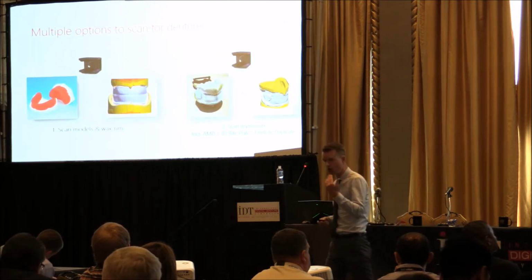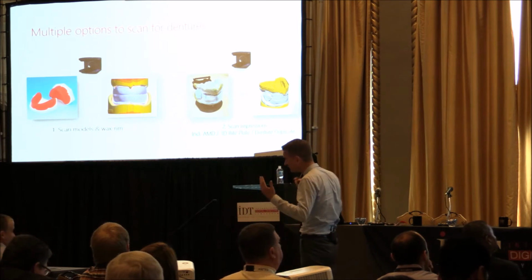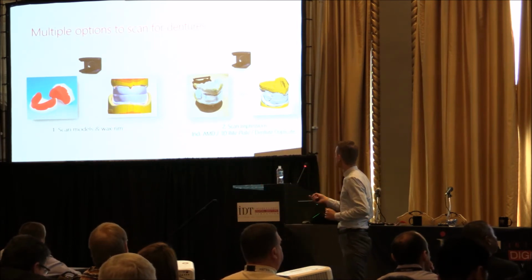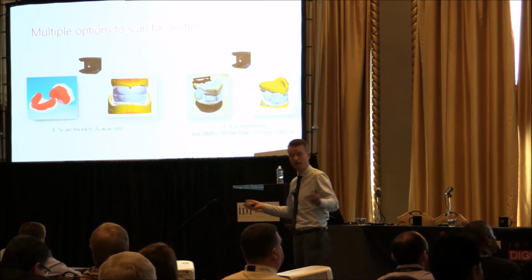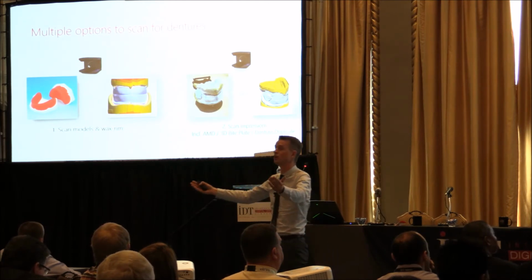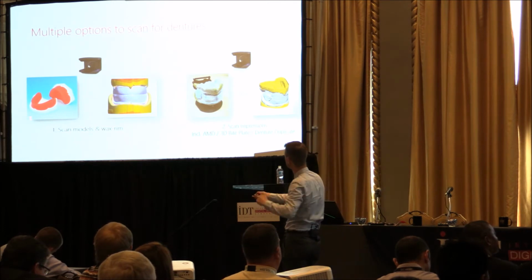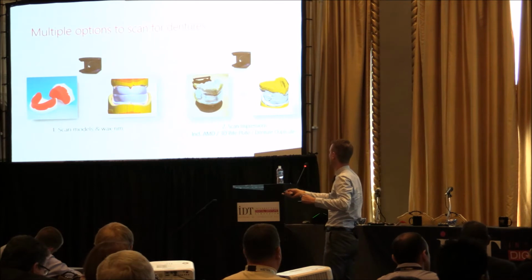Okay, so going forward to actually capturing the data, so to speak. There are, besides the intraoral scanning, which we'll get back to, two main ways you can say. There's scanning models today, so no revolution, just evolution. We scan the gypsum models, we scan the wax rims as they are today. We do 3 scans, the upper and lower model, and the wax rims together.